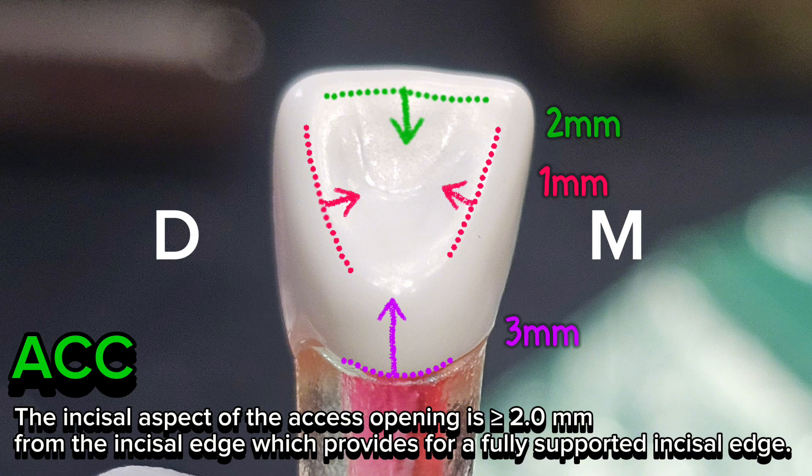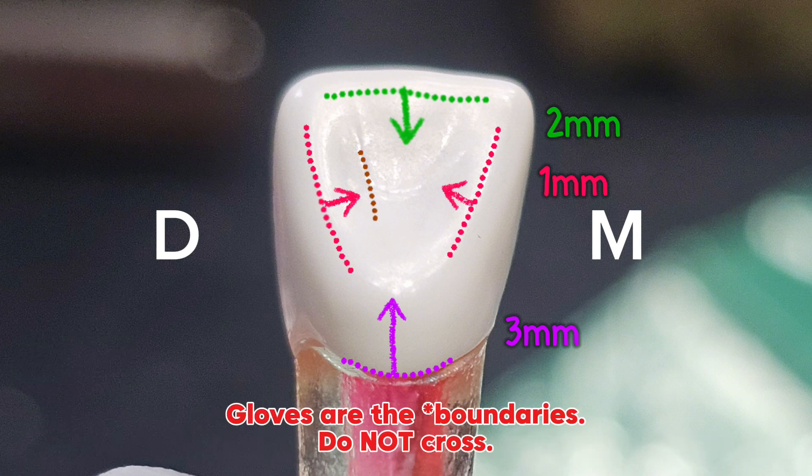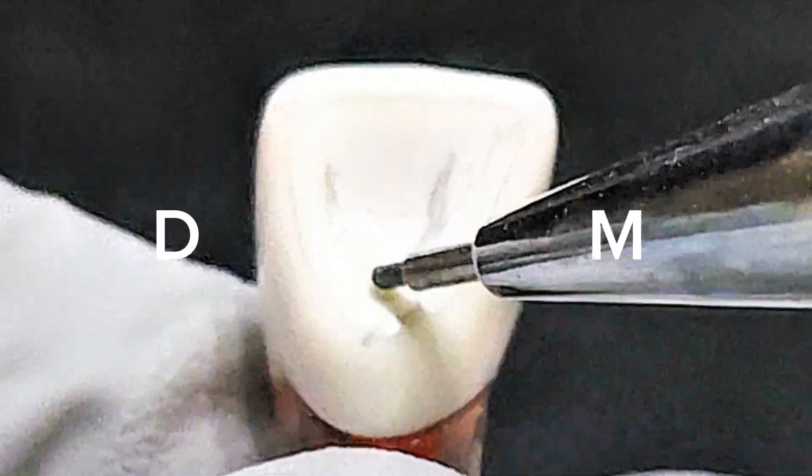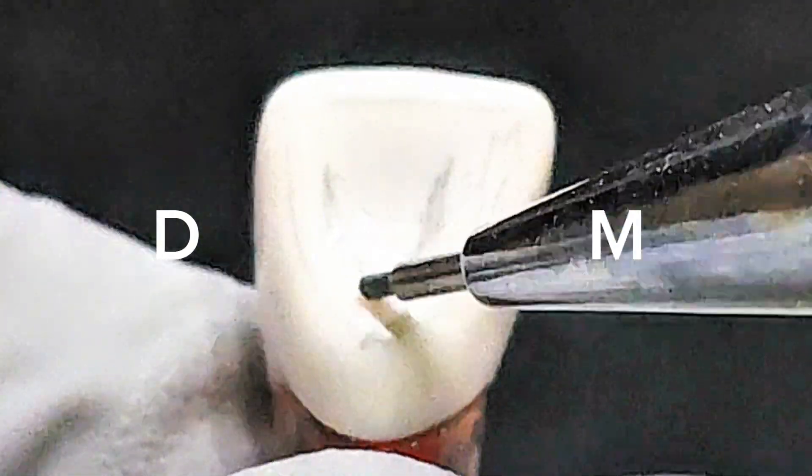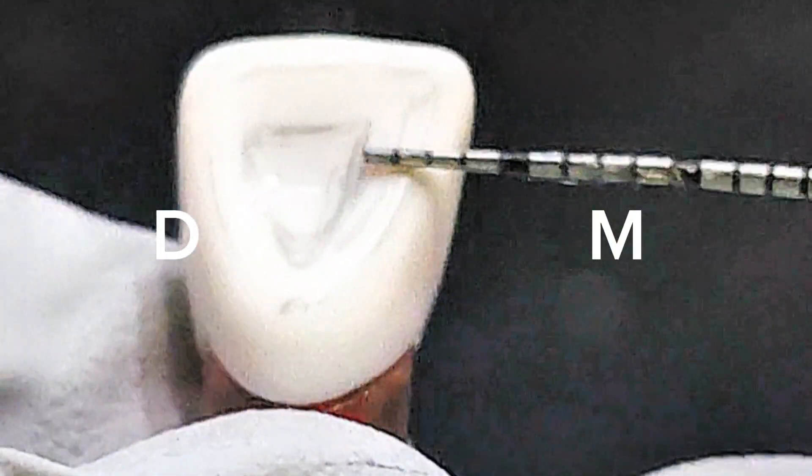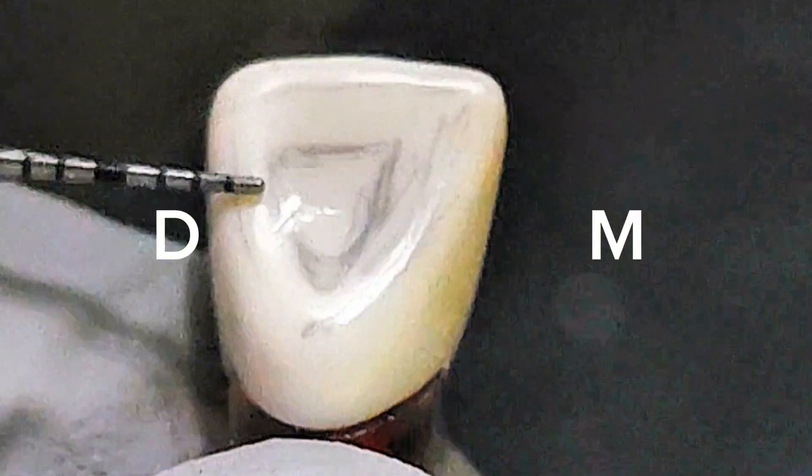My professor said if you just follow the grooves, then it is good enough for the access prep. So let's check. 1mm exactly 1mm, and this one has a little bit more room 2mm, and 1mm. Probably it is more than 3mm, it is almost like 4mm so you can deepen it more here.